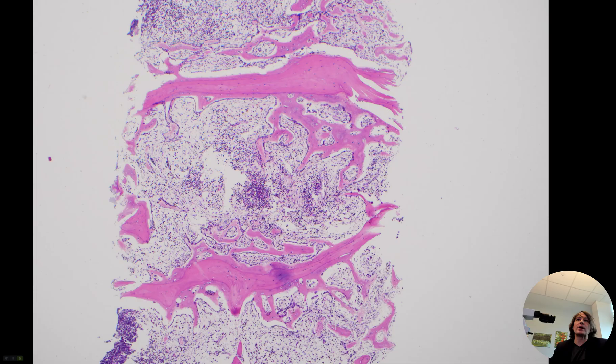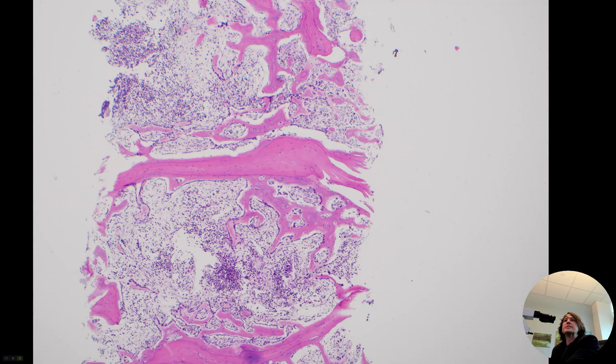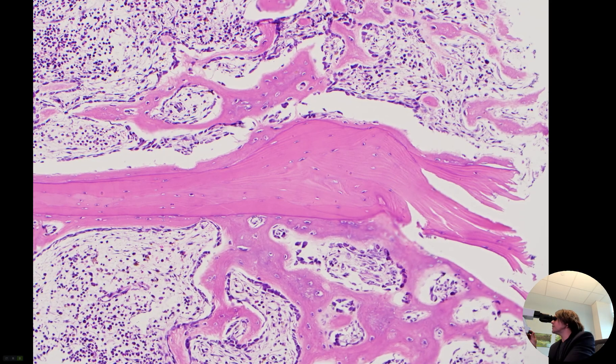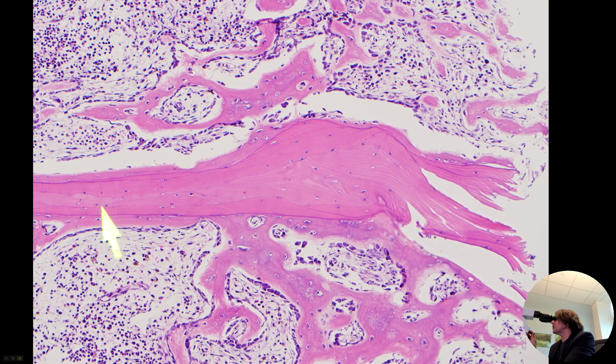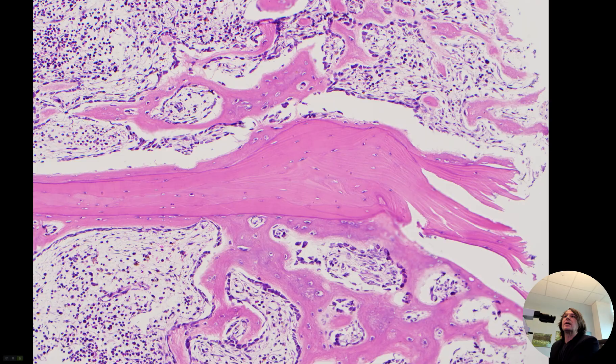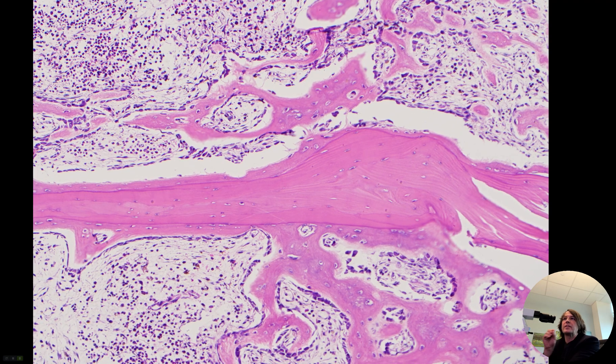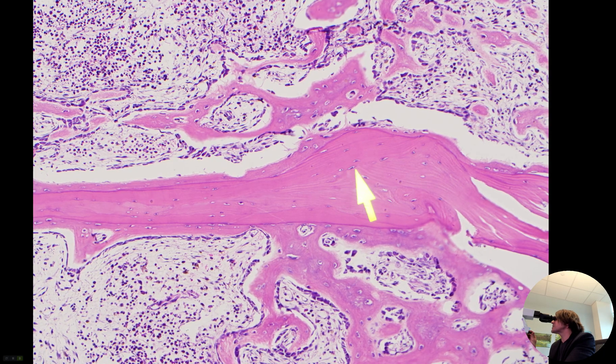This is from a compression fracture of one of the vertebra in the spine. What you can see here are these long bits of bone — this bone has been decalcified, that's why it looks pink, otherwise it would look kind of purple on H&E. You can see these parallel lines called lamellar bone lines, and we see that in mature bone, both the bone cortex on the outside and the trabecula, the spongy bone in between. That's normal native pre-existing bone; the little spaces are osteocytes.